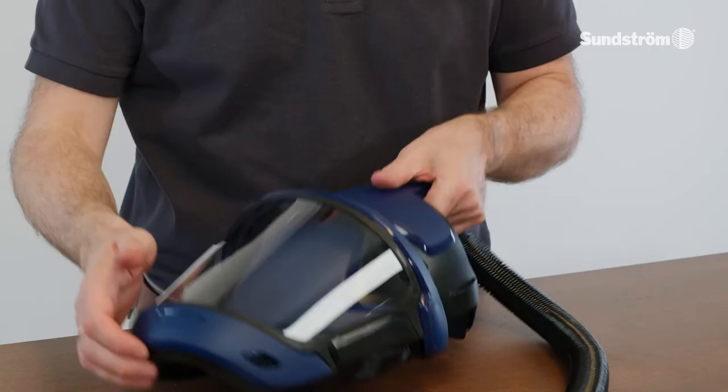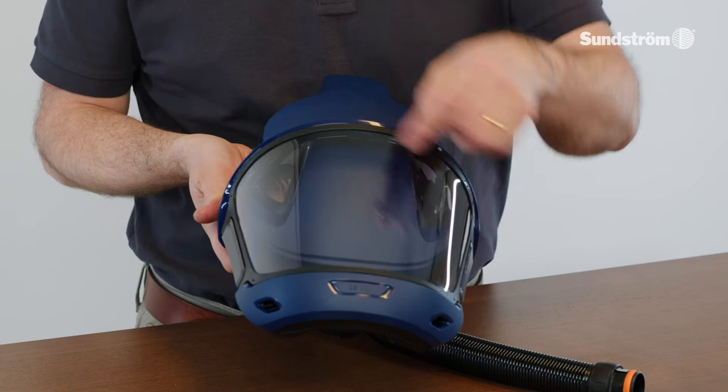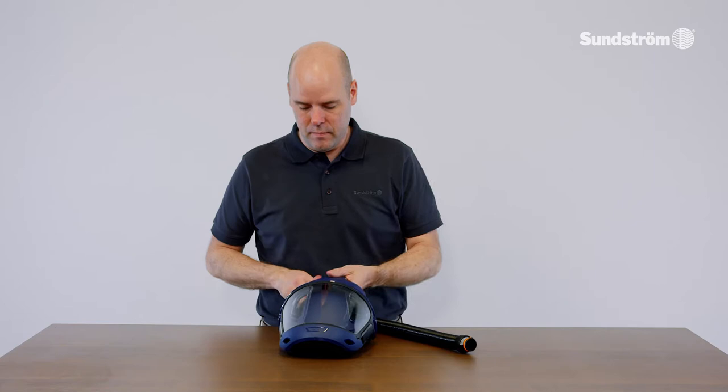Check that the visor is properly locked. If the visor has any scratches or cracks that affect optical properties, you should replace the visor. Check that the exhalation membrane and exhalation cover are in place.